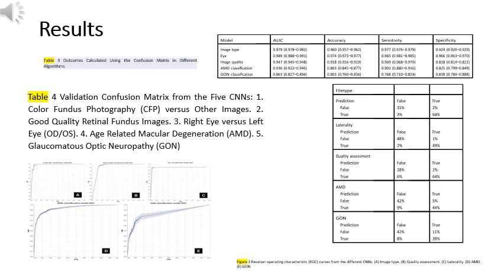CNNs for evaluating diseases had an AUC of 0.936 in the case of age-related macular degeneration, AMD, with an accuracy of 86.3%, and an AUC of 0.863 with an 80% accuracy in the case of glaucomatous optic neuropathy. The algorithm for detecting AMD had a sensitivity of 90.2% and a specificity of 82.5%. In the case of glaucomatous optic neuropathy, GON, sensitivity was 76.8% and specificity was 83.8%.